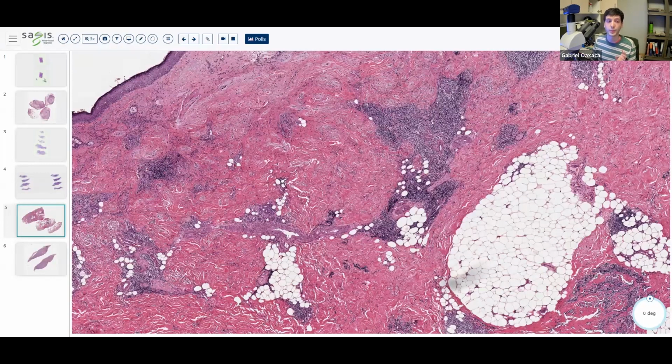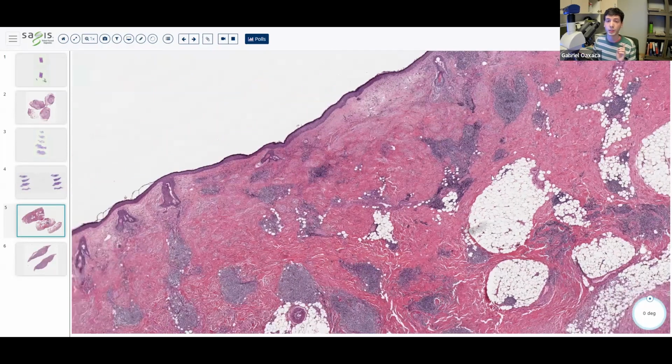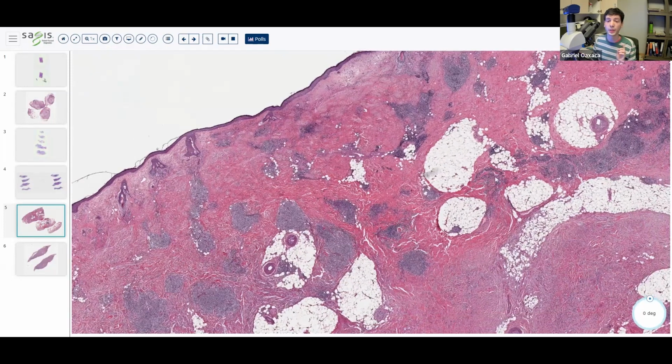This is desmoplastic melanoma. And some important notes about it, we note that it is huge and it is very deep. So it would have technically a high pathologic T stage. And so high stage equals poor prognosis, except not in this one. Interestingly, this lesion, although it may recur locally, it is incredibly rare for it to metastasize. So long as the criteria for a desmoplastic melanoma is used rigorously and accurately, you're basically guaranteeing, well, not guaranteeing, but getting pretty darn close to a guarantee that this lesion will behave much, much, much better than a superficial spreading or lentigo maligna melanoma of the same depth.